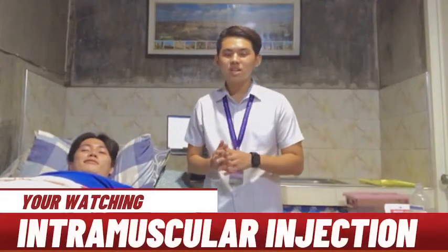Lastly, we'll be performing the intramuscular injection. So a quick recap, this is the introduction of medication deep into the muscle tissue where a large network of blood vessels can absorb it readily and quickly.